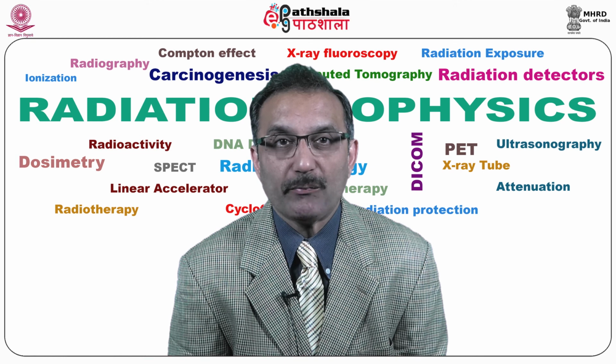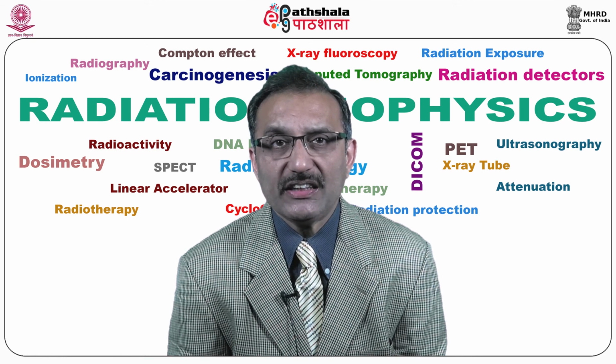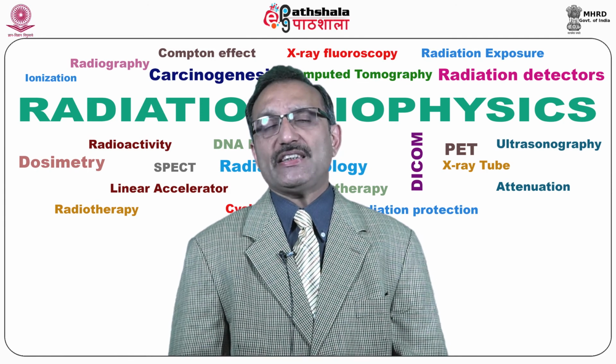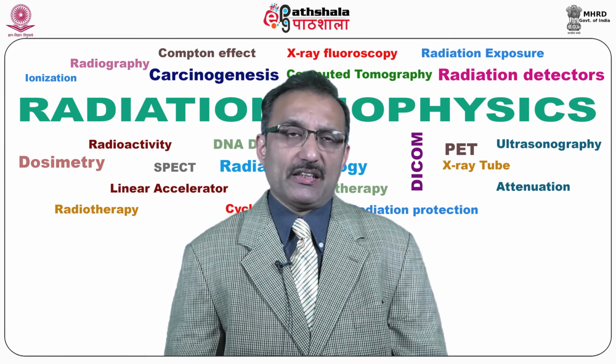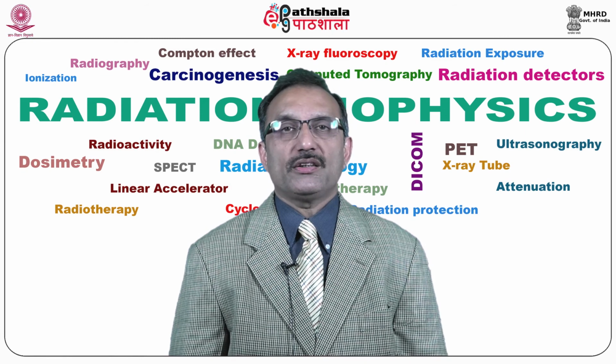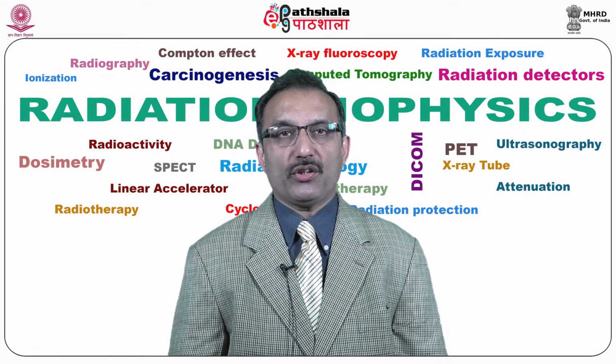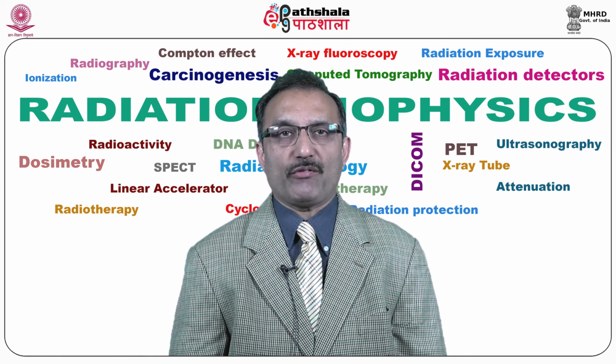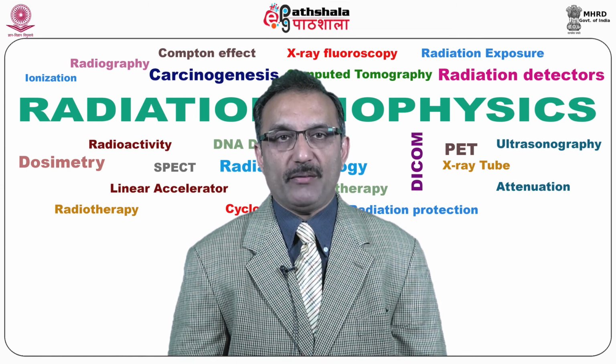The traditional approach is what? Obtain CT and PET images separately, then register the CT and PET images to help interpretation of the PET images. Either you register them separately, as I was discussing in the previous slide, or a mechanism has to be developed so that both are fused together, the images taken at one point of time of PET and CT, and you get a good quality image.